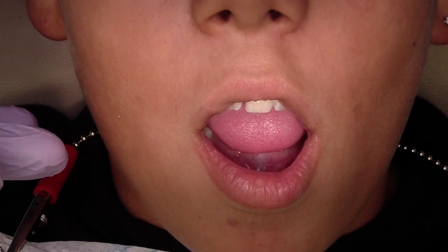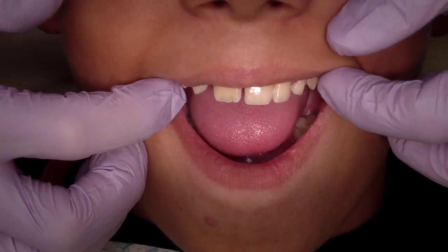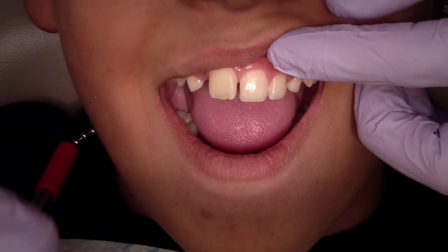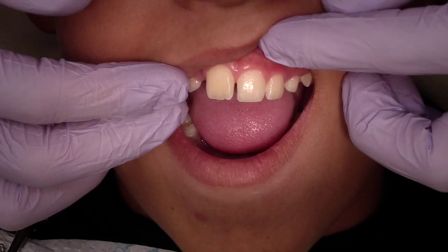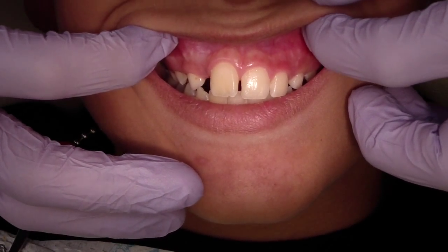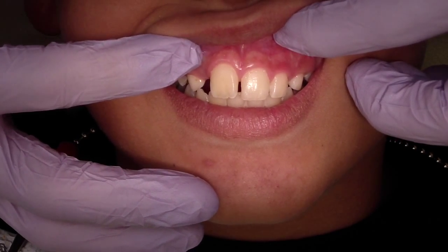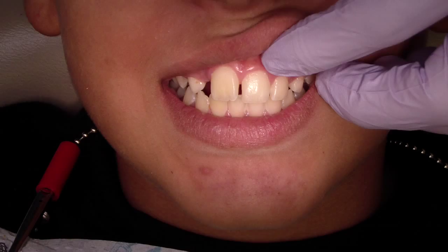Hey folks, Ashley from allthingsdentistry.com. My dental assistant and this child's mother are in the background laughing. This young man here has a tooth size arch size discrepancy, so we're going to make him a rapid palatal expansion device.